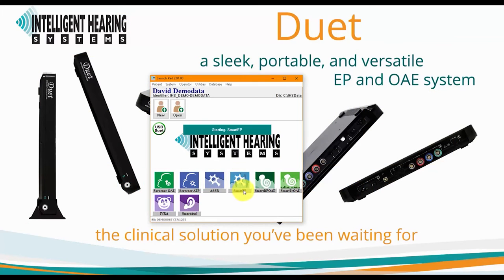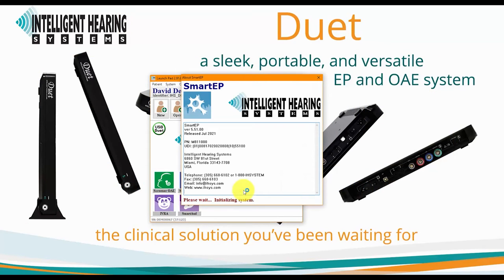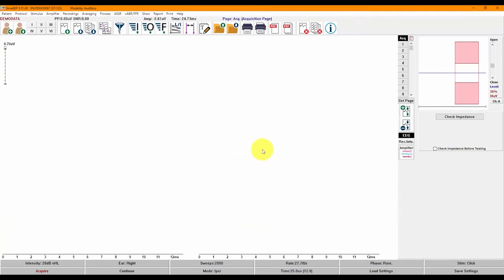Now we will switch gears and launch the SmartEP software for an overview of the interface. Below the streamlined menus in the user-friendly interface of SmartEP, you will find large accessible buttons on the toolbar that provide easy access to the most commonly used functions. As you hover over each button, a description of its function will be displayed.